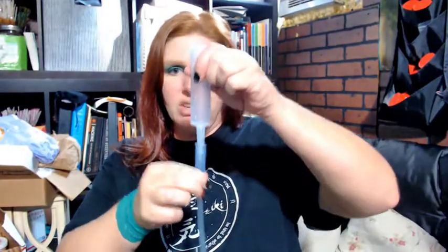Yeah, so whenever I need to feed myself, I just attach this to that thing in my stomach, stick this in the top, and I just pour the formula and the water in it and just let it drain in with gravity. And so I carry a syringe and this attachment and of course the formula and some water around with me wherever I go so that I always have it.